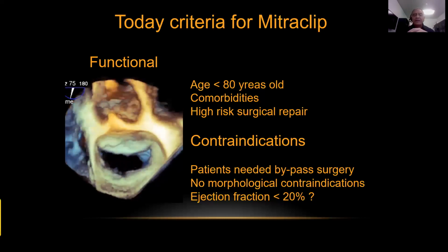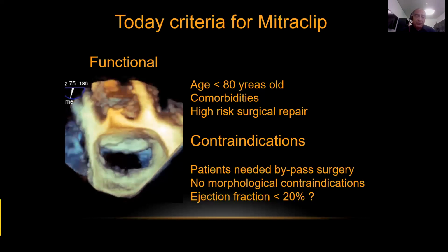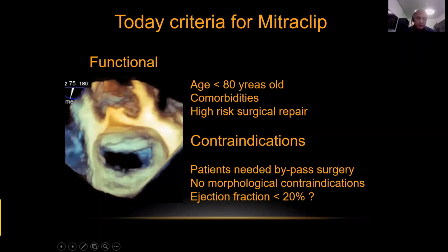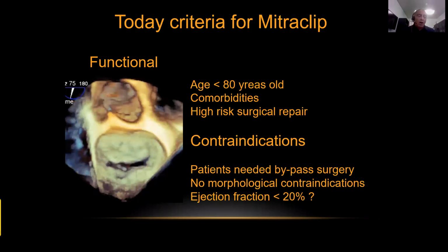All of you know the MITRA-FR and the COAPT. Well, when the left ventricle is at end stage, probably we do not improve the survival of the patient. But believe me, we improve the symptomatology. Symptoms of the patients clearly are reduced after one or two clips. So ejection fraction less than 20 is not anymore a problem for us, because we talk with the patients. We know that there will not be an improvement in survival, because the survival is mainly due to the left ventricle dysfunction, but there will be an improvement of symptoms.